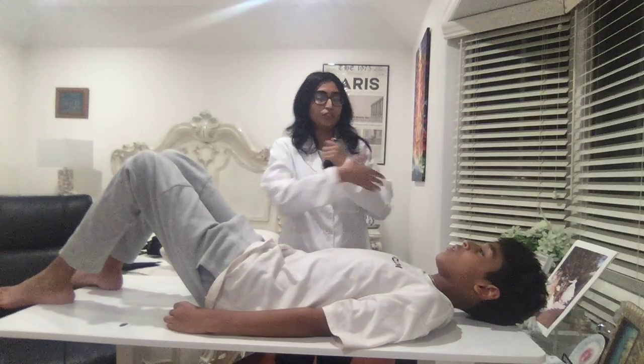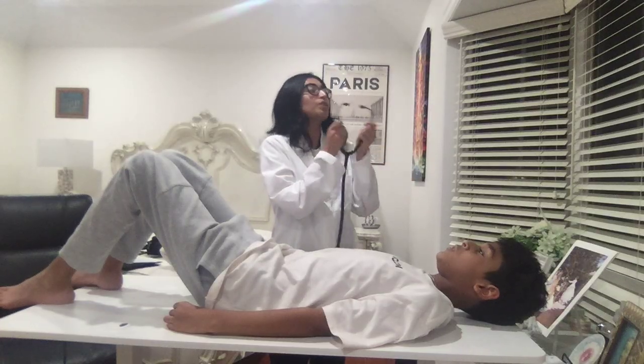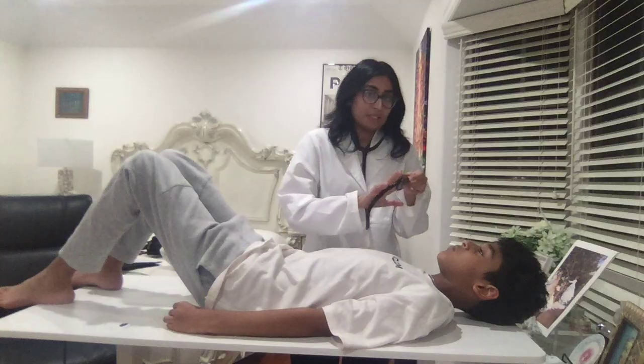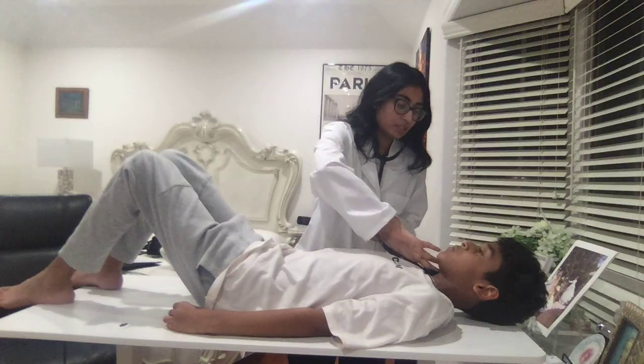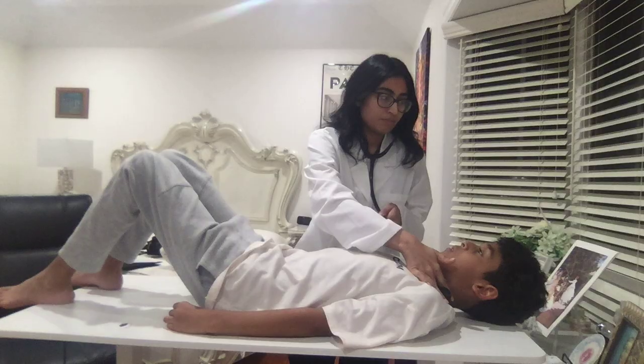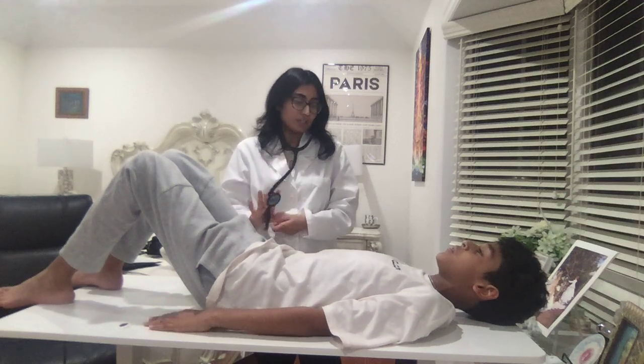Now we've concluded the palpation portion of the exam, so we can move on to the auscultation portion of the exam using the stethoscope. So we are going to auscultate the carotid arteries first for bruits. Right carotid, left carotid, and we hear no bruits on either side, so we are going to move on to auscultating in the other regions, the valves.